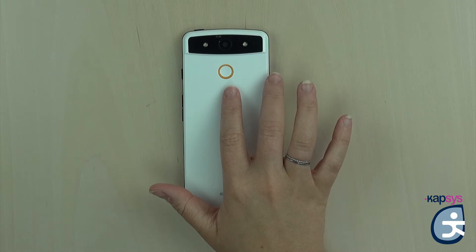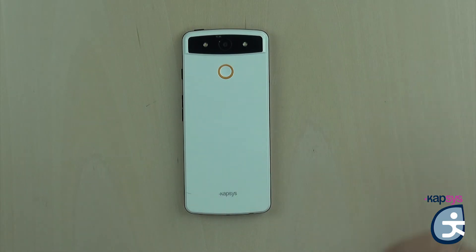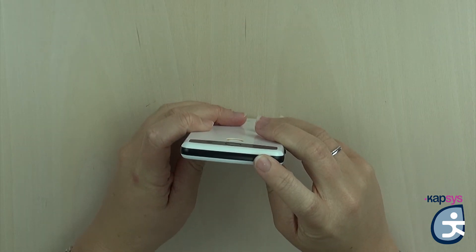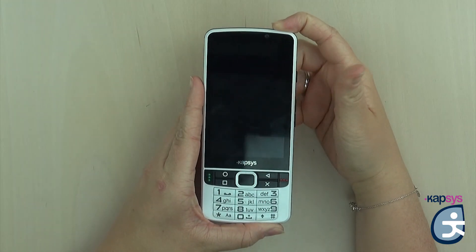The SOS feature is essential in case of emergency. It allows you to register up to 10 contacts to send them cascading calls and geo-localized SMS. Now we are done with the description of the different keys. Let's start the product to see what happens the first time you turn it on. Just press the button on the top right of the upper part of the Smart Vision 2 for three seconds to turn the phone on.